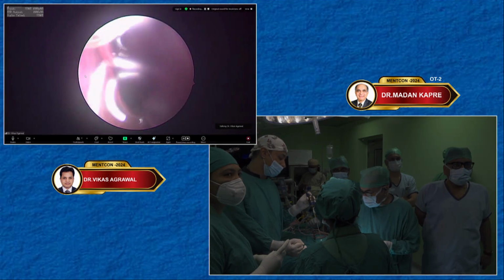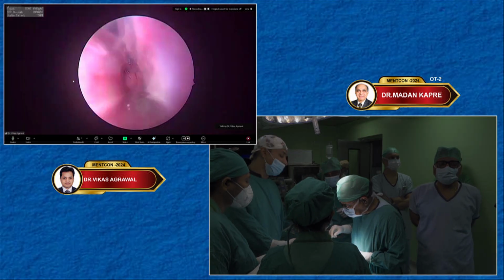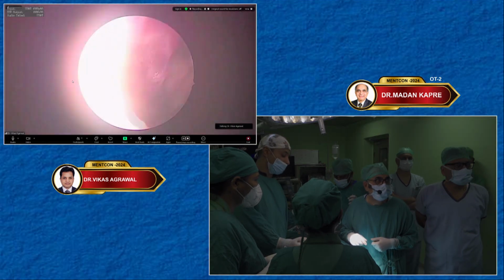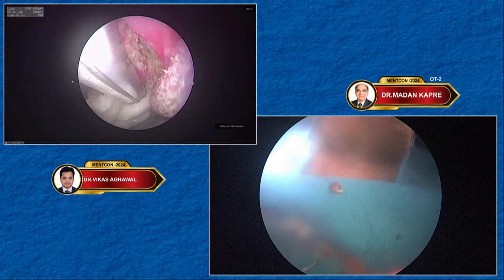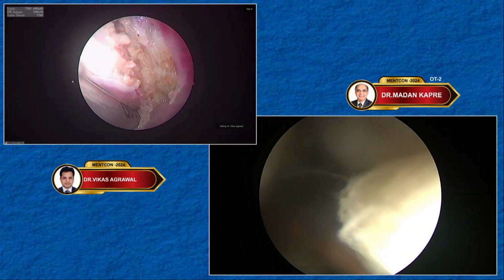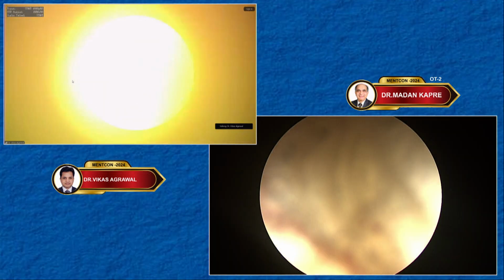The audience is asking about intra and extracapsular tonsillectomy. All right. I have performed intracapsular tonsillectomy on this child. This is the intracapsular tonsillectomy. Can you see that I have not removed the last layer? I have gone till the capsule. This is a completely painless and bloodless procedure. I call it CCIT, complete intracapsular coblation tonsillectomy.